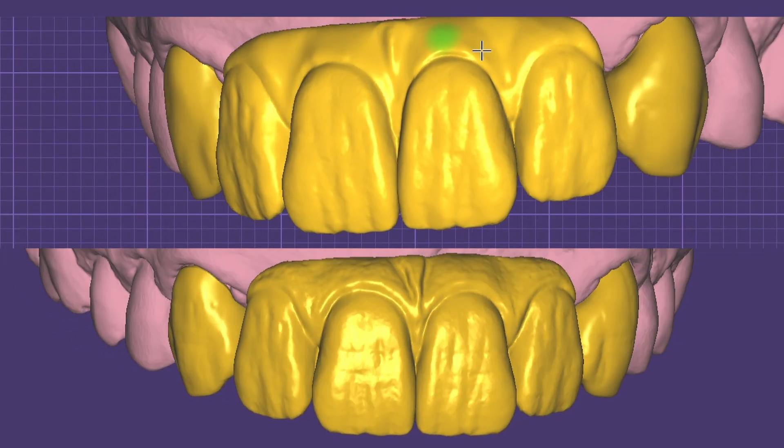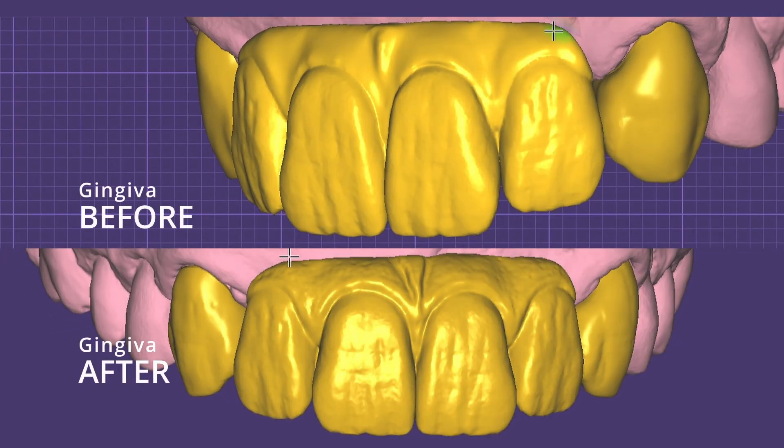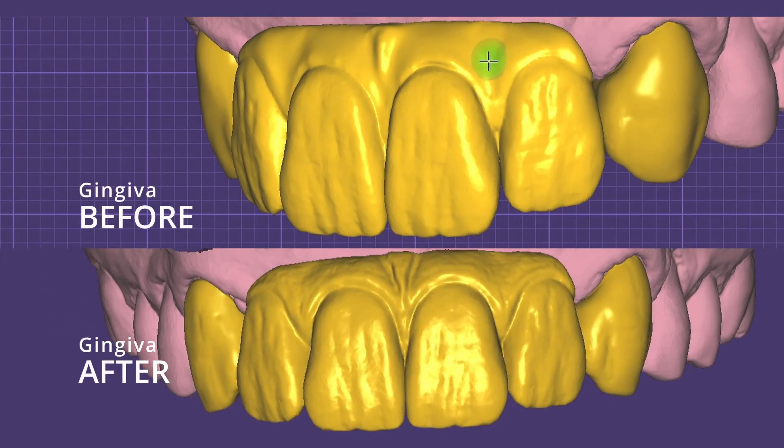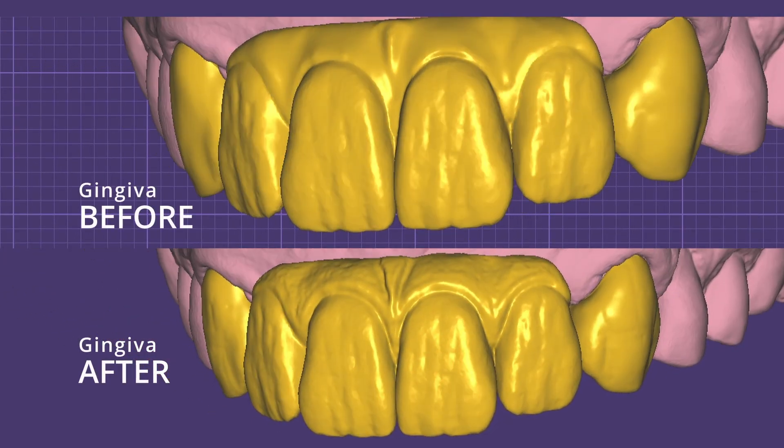Today we're going to take a design that I did in the last video and improve the gingiva to make it more realistic.